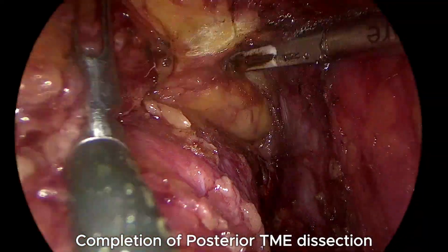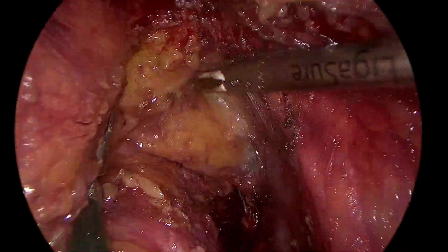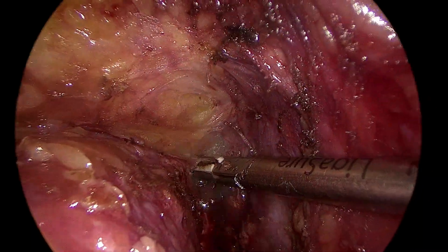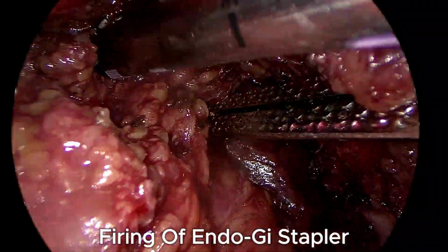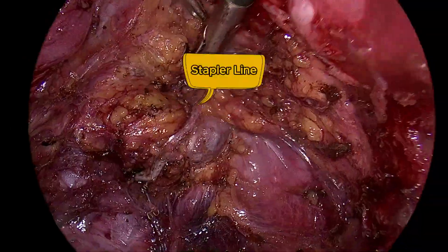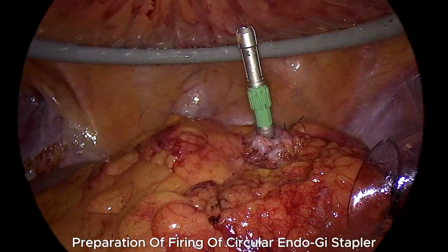Anterior and posterior total mesorectal dissection completed. After dissection, 3 purple endo-GI staplers were fired, mass resected and anastomosis done by firing a circular endo stapler as you can see in video.